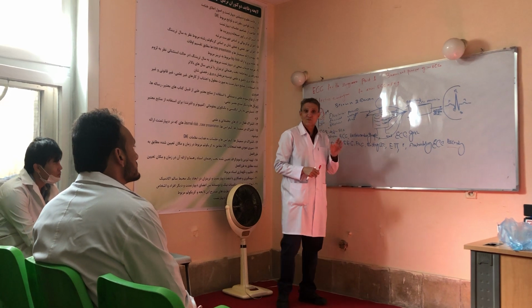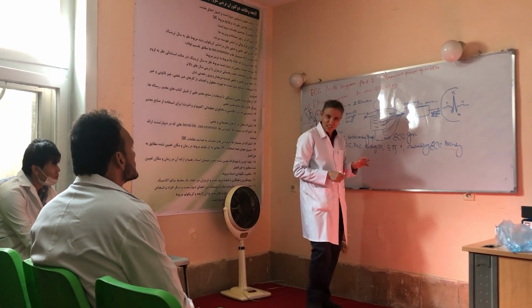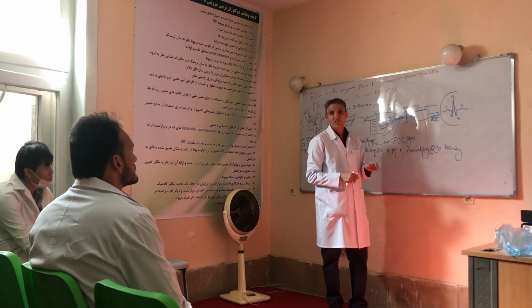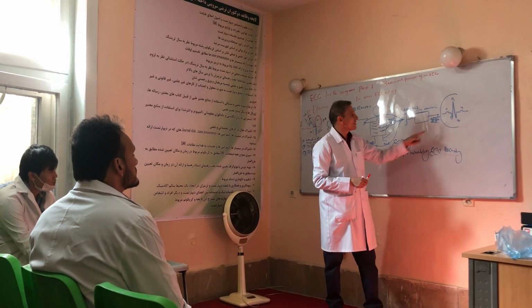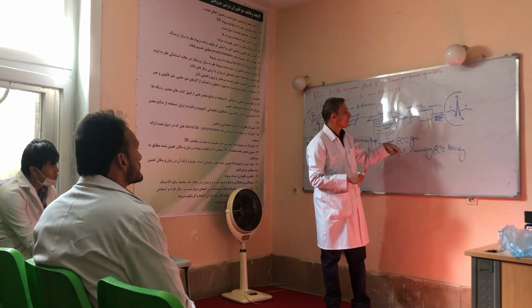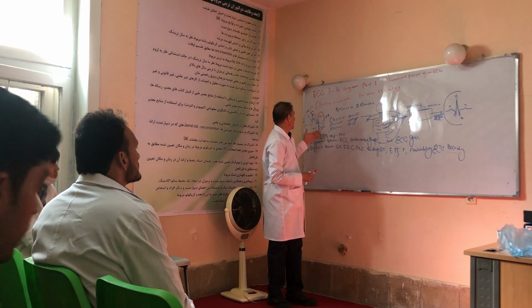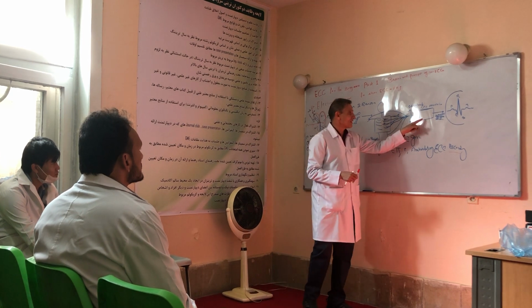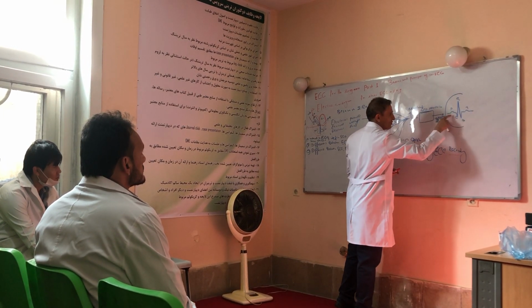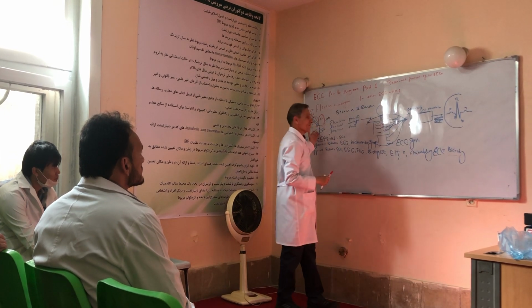Remember, you should memorize PQRST and also focus a little bit on the U. U is also in some cases important, but the PQRST should not be forgotten. So my lecture will be started from this part up to where the first lecture produces this PQRSTU. That is why I draw this simple diagram of the heart.